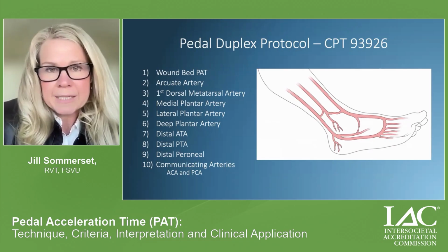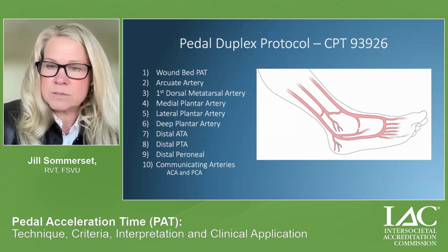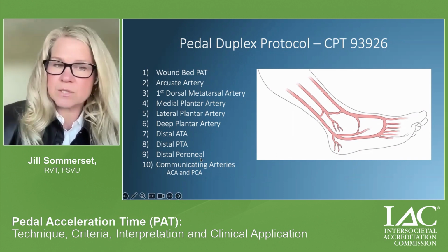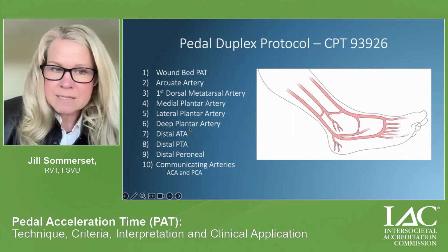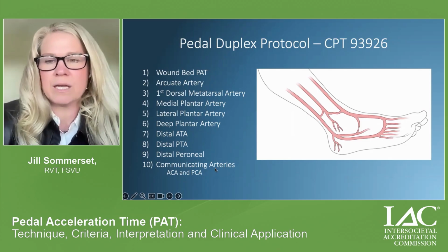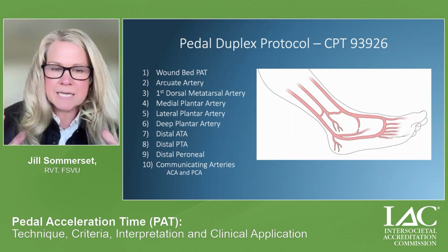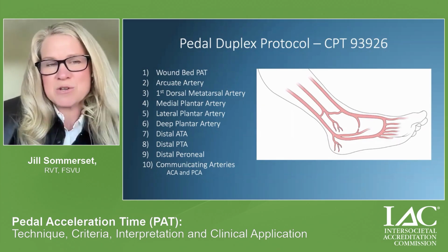So, in regards to a pedal duplex protocol, which is a billable code at 93926, this is a limited unilateral duplex ultrasound. We're going to evaluate the wound bed PAT first. And just like I said, the arcuate, first dorsal metatarsal artery, medial, lateral, and deep plantar, as well as the distal anterior tibial, posterior tibial, and peroneal artery, and then evaluate the communicating arteries. I'm going to talk about how we integrate PAT, this pedal duplex, into clinical practice and where it provides the most value. So just stay tuned for that.